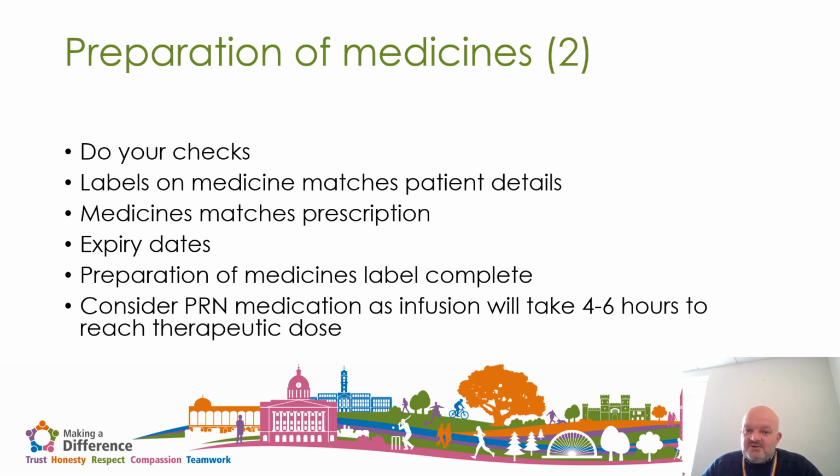And also, because we talked a while ago about the fact that it can take a few hours for the infusion to get to a therapeutic level in the system, if a patient has got uncontrolled symptoms, it may be that they need PRN medication when you set up the driver in order to try and cover them until the driver kicks in properly.